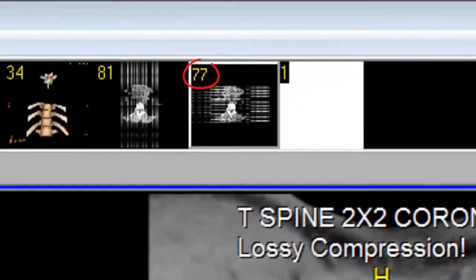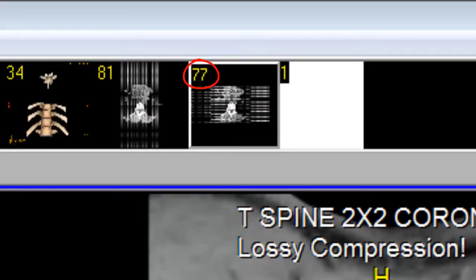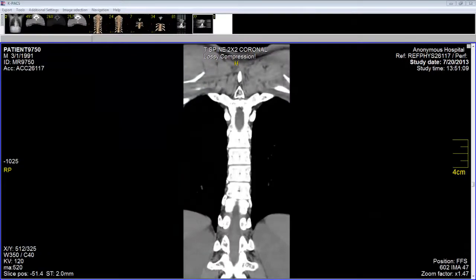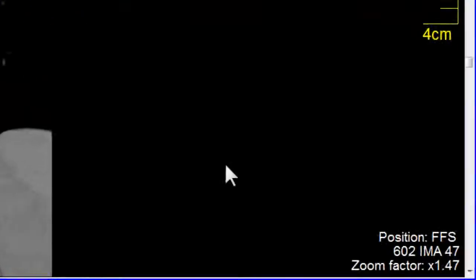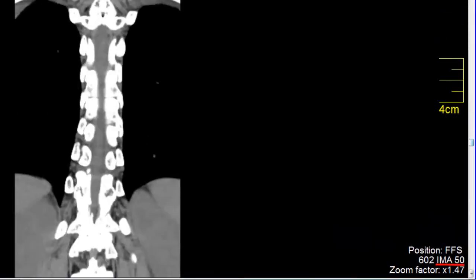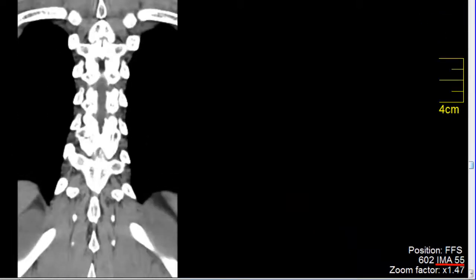This stack of coronal sections has a total of 77 slices. As we scroll up and down through the stack, how do we know what section we're looking at? The answer is found in the bottom right-hand corner. We're looking at image 47. As I scroll down through the stack, the numbers get larger.